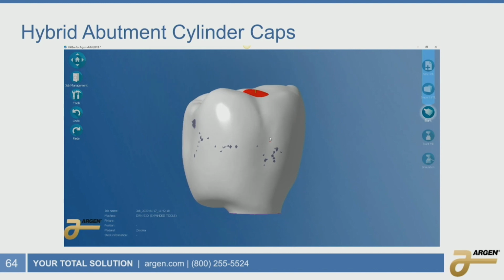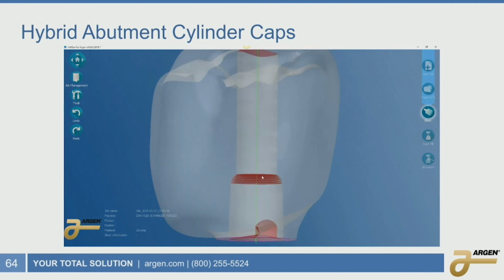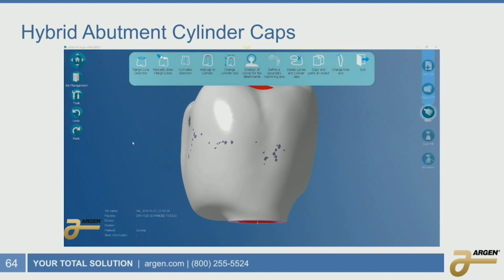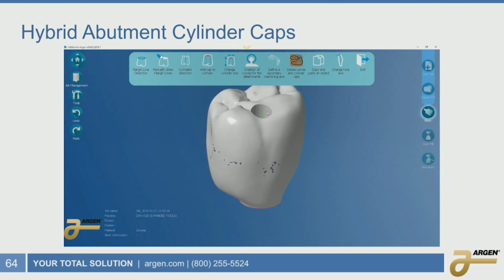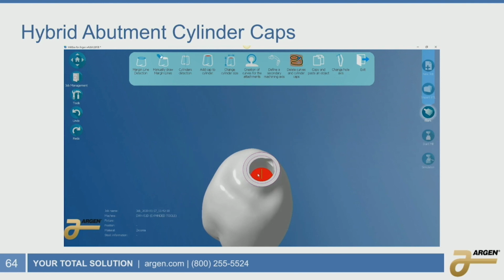So right here we can see one was put down at the interface surface, which is incorrect. And we can also see obviously a lot of internal surfaces there as well. So we come in here under the tools menu and then come down to curves and surfaces. And for this situation, since this has wrong curves, we'll click on delete. And then you can just manually click on the various curves or red cylinder caps to remove them completely. Once you've removed all the surfaces, then we can go back in and properly identify the various surfaces.